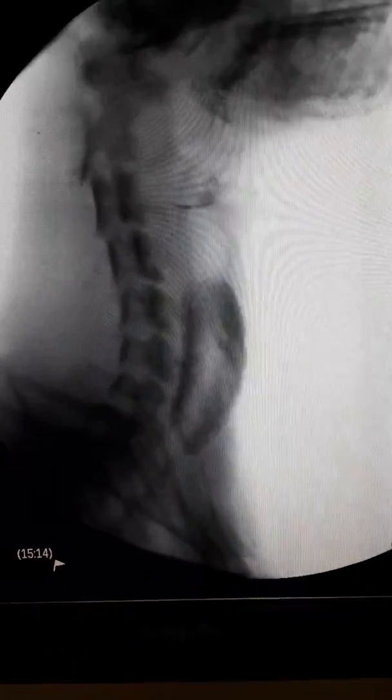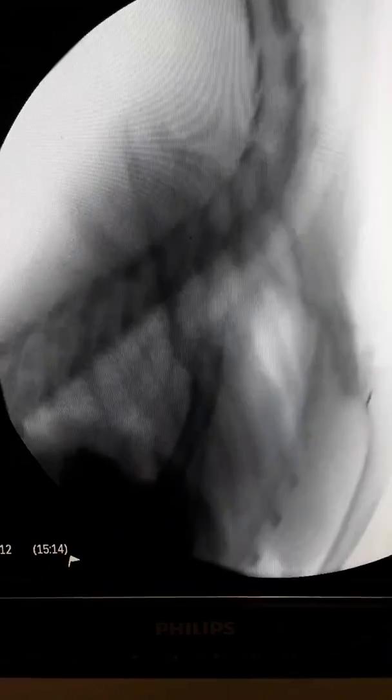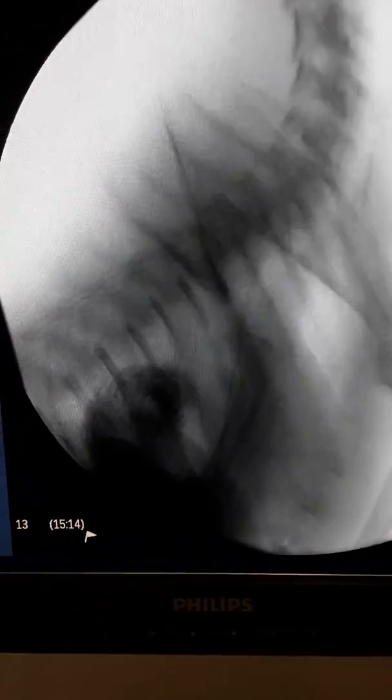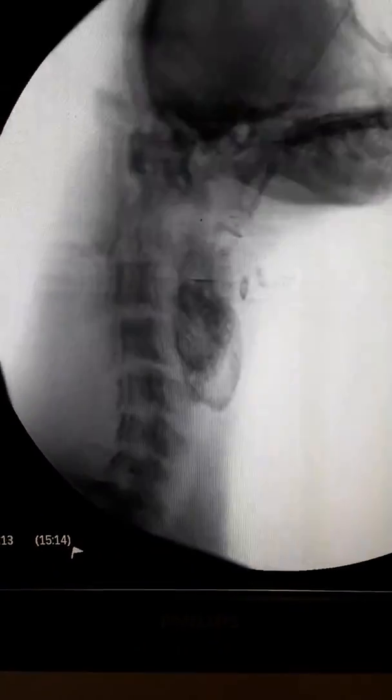Next we gave her a meatball — it was a pretty big meatball. It swallowed pretty well and made it down actually quite rapidly. We weren't able to catch it going into the stomach, so we gave her another one. That one we were able to follow all the way down through the esophagus and immediately into the stomach through the lower esophageal sphincter. So that went really well.